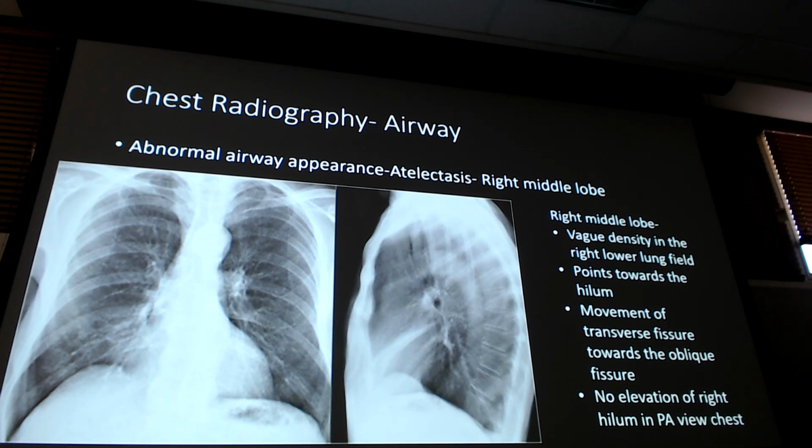Okay, questions on that so far? When you do Radiopaedia, look up atelectasis, you're going to get a lot of different things. So if it just looks crazy, find a different image, right? Try to get an idea. Lung stuff is really difficult to find just one disorder with. Sometimes you can get more specific, and it's a little bit easier if you do like right lower lobe atelectasis or right middle lobe atelectasis.